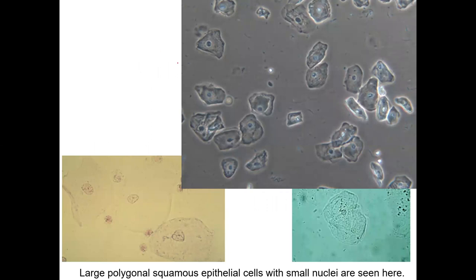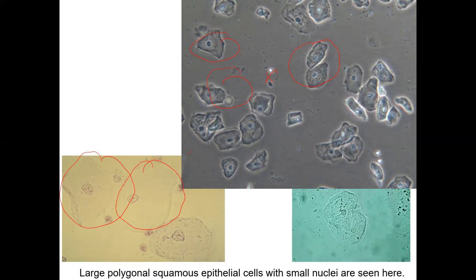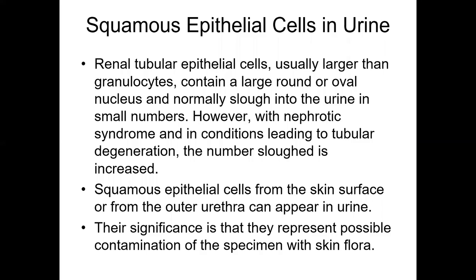These are epithelial cells, which of course can be pathological. They look almost like squamous cells. This could be seen with tubular necrosis too, or some kind of damage to the glomerulus could bring these into the urine. Some causes include nephrotic syndrome, which you're probably covering in lecture, where cells are sloughed off from the kidney all the way into the urethra.